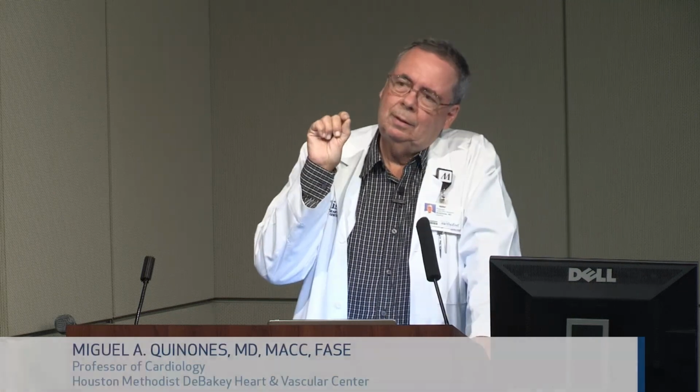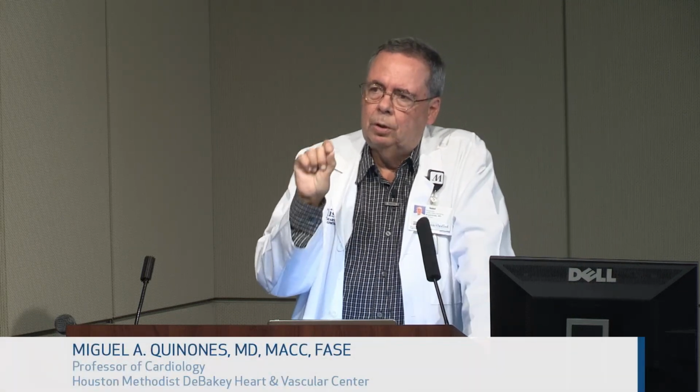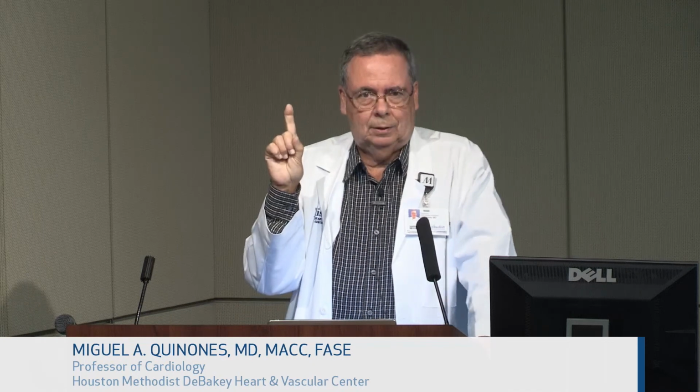So that sentence was placed in the report to be used only in one instance. If you have a lousy jet, and despite having a lousy jet, you still get a PA systolic of 50, then you say, yeah, it's important because you're saying, it's not a very good jet, but it's at least 50, which is bad. It's like saying, I'm not sure what the EF is, but I can tell you it's at least less than 40. Okay, that's giving me some help as a clinician. But if you're telling me it's a lousy view, I don't know anything, I cannot see anything, but the EF is at least normal. Yeah, really?